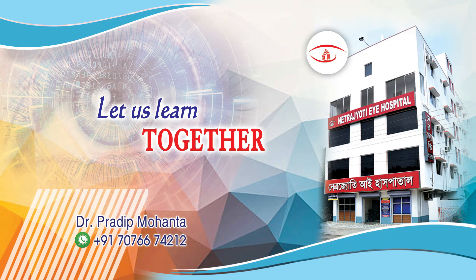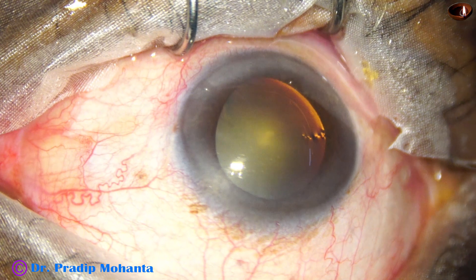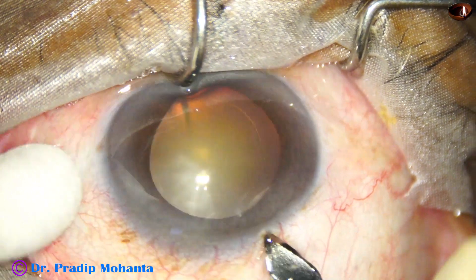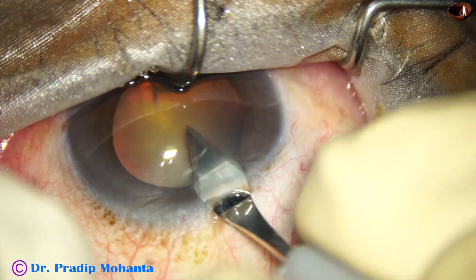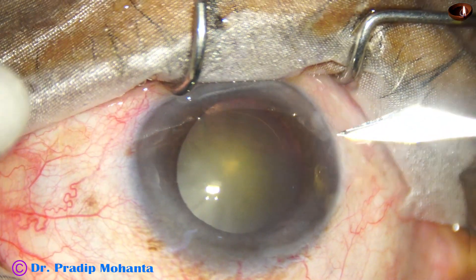Management of a cataract with floppy iris becomes easy if we pre-chop the nucleus. This patient is on Tamsulosin for benign prostatic hyperplasia, so we are expecting floppy iris in this case. Let us observe this surgery.